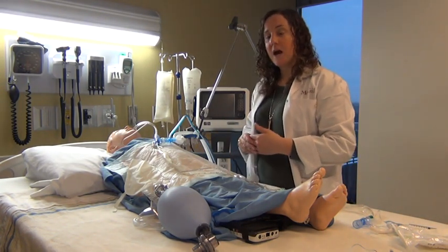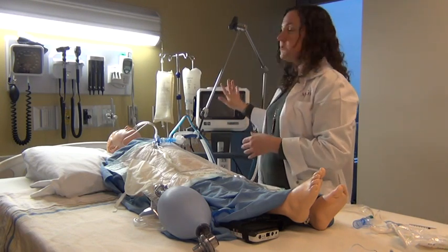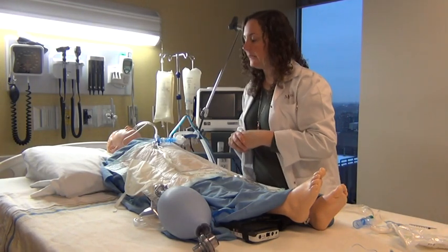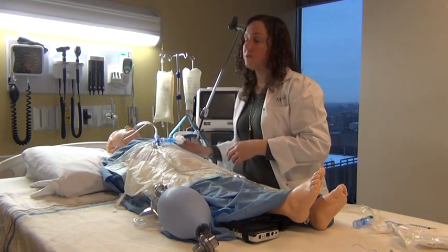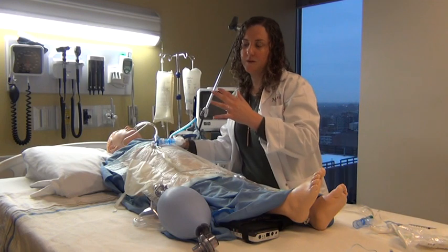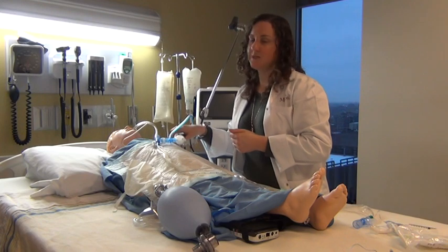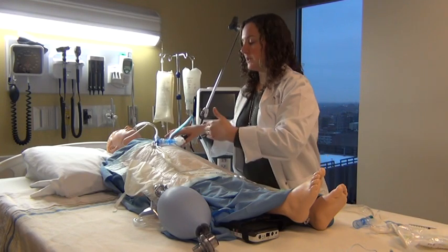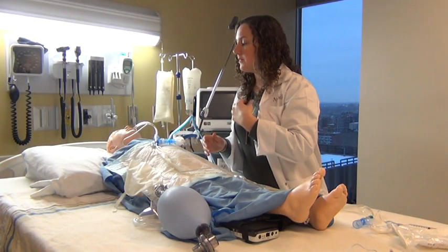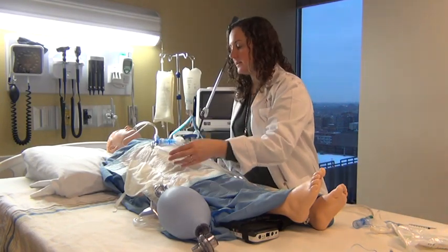They often can't tell you they have secretions, so one way to actually know if they have secretions, sometimes you'll see it very clearly on the monitor, as a lot of the waveforms will be very wobbly and scribbly. Another way is through your assessment as you're auscultating the lungs. Sometimes just putting your hand on their chest, you will feel their chest vibrating, and you would actually know that they have secretions. Or the other option is as you just hold the tubing, you will actually feel them vibrating quite a bit. And so that's usually an indicator that there are secretions in the large airways that you would be able to easily go suction out with this inline suction.